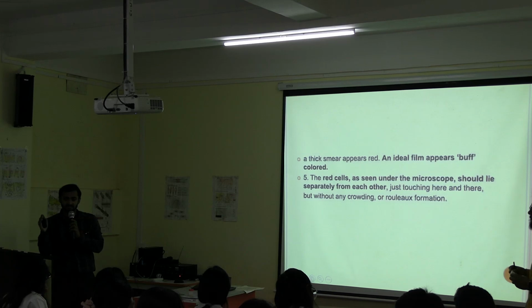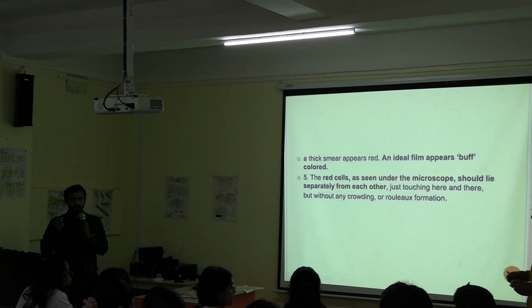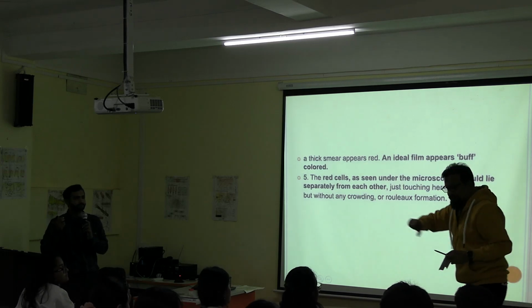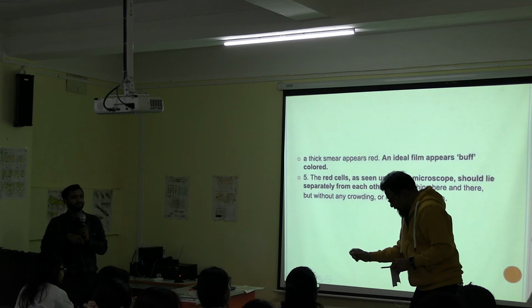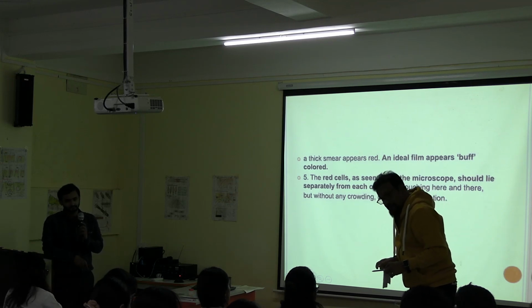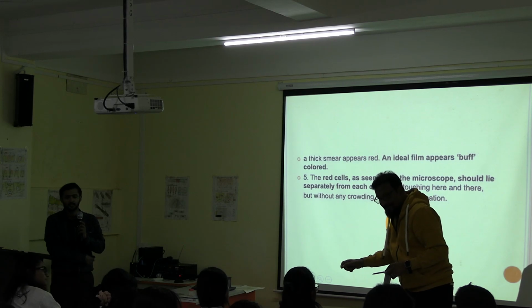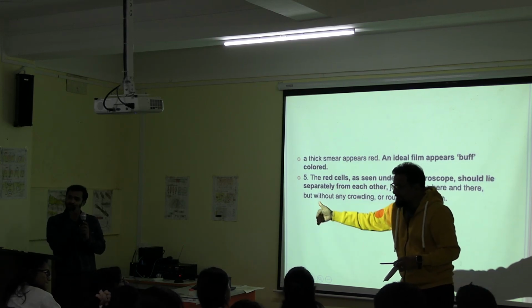Ideal blood smears may look tongue shaped, but what are the characteristics? What are the points? How should it look? There should not be any striations when you are pushing. If your push is jumpy, then you will find thick and thin areas.